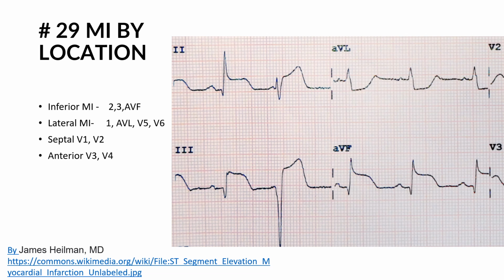Now, the other thing that you're looking for is the number of leads that this is happening in. It's kind of like, for example, if you're doing an evaluation of Walmart, and I got one customer saying, oh my goodness, that store was terrible, everybody was standing around doing nothing, and she's the only person complaining about this, I'm going to take that with a grain of salt.